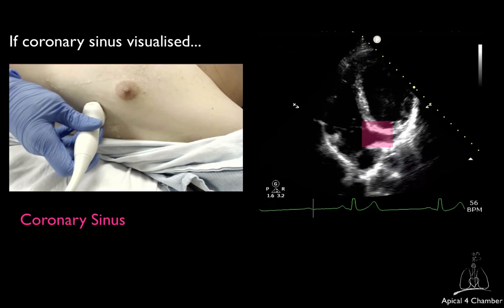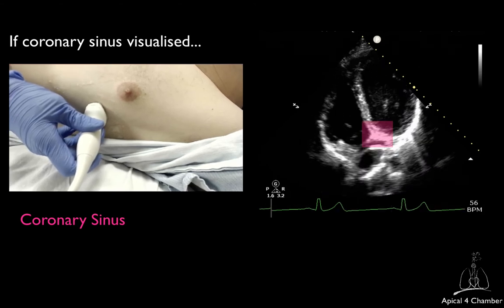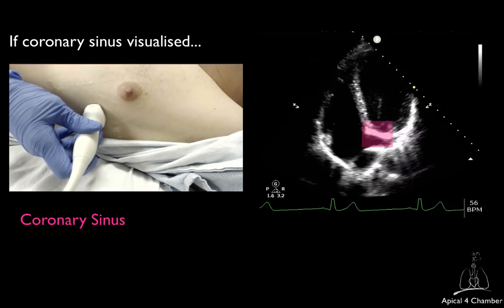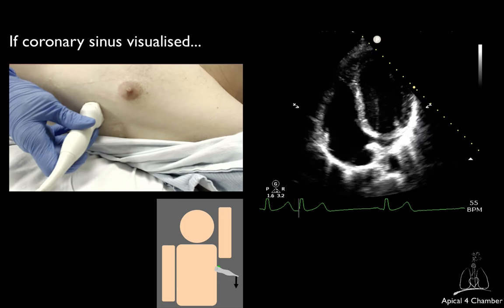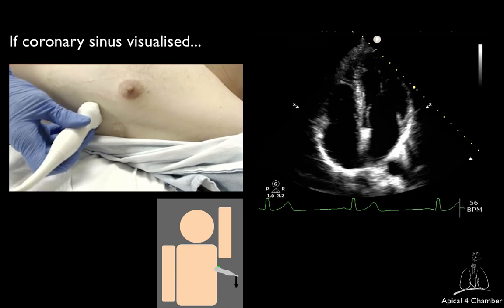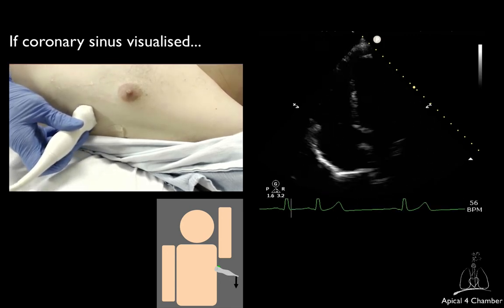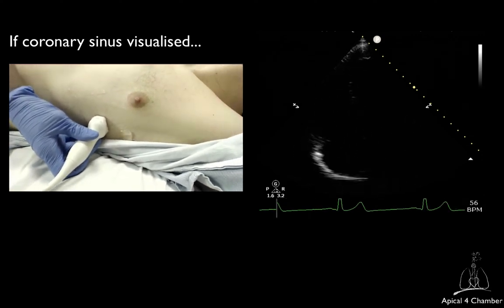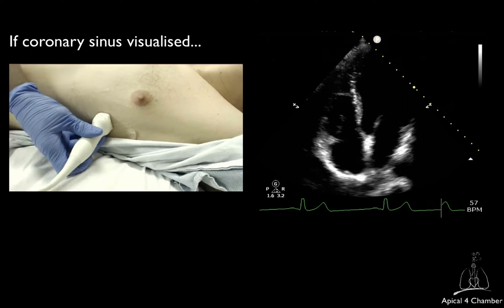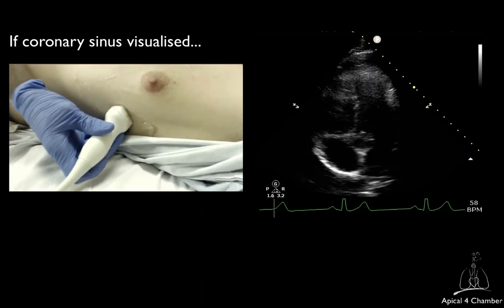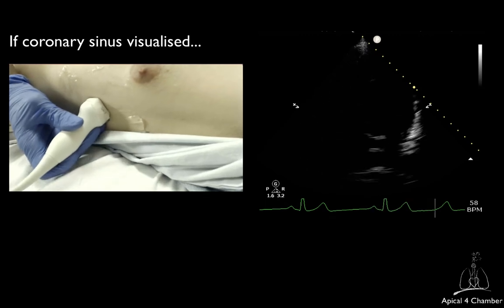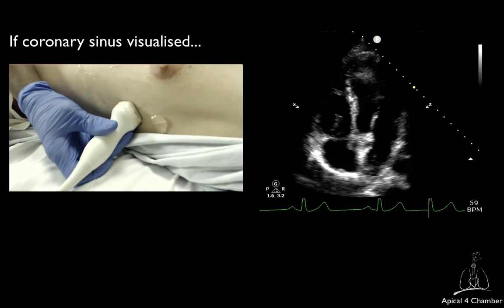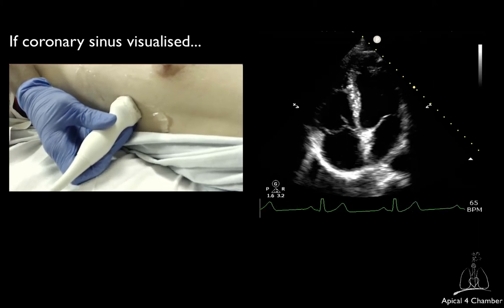If you visualize the coronary sinus and the left atrium is cut off, you are directing the ultrasound beam too posteriorly. You will therefore have to tilt the transducer tail downward to direct the ultrasound beam more anteriorly. Sometimes, by doing so, the quality of your image may deteriorate as the ultrasound beam may be obstructed by the superior rib of the intercostal space. If that happens, you will have to slightly move the transducer within the intercostal space to readjust the ultrasound beam within the space.